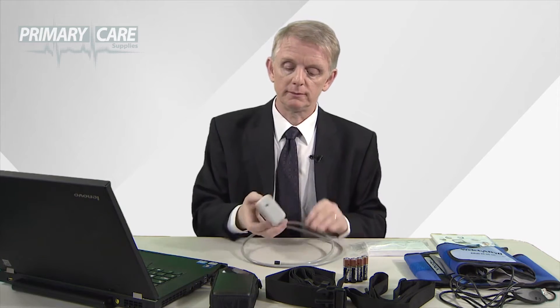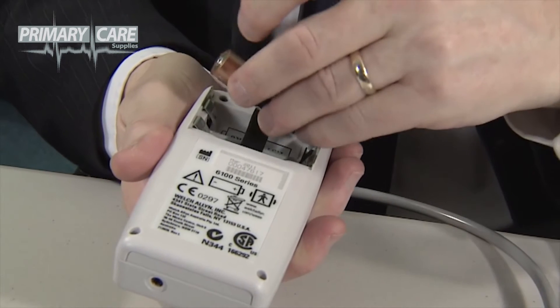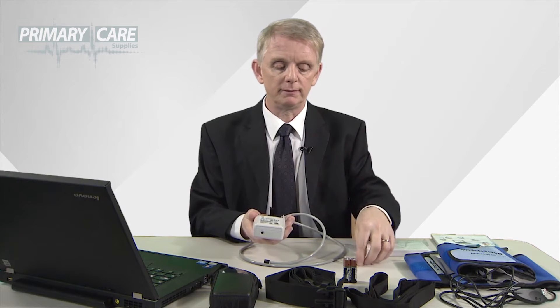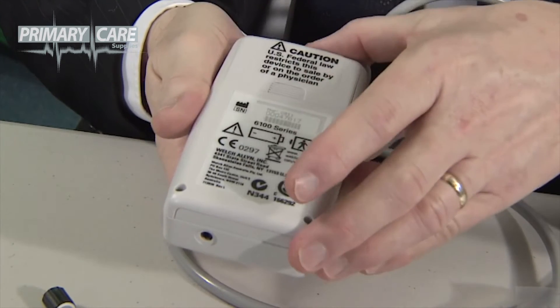Most of the test preparation work can be done before the patient comes into the room. Take the lid from the back of the unit and place 2 AA batteries into position with a tape underneath them. Fold it back over and slide the lid back into position.